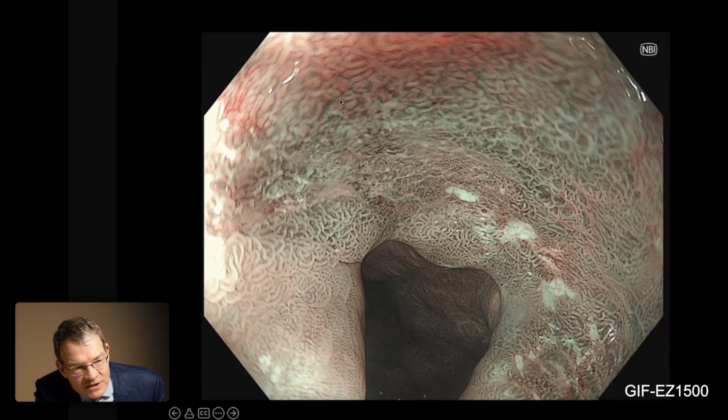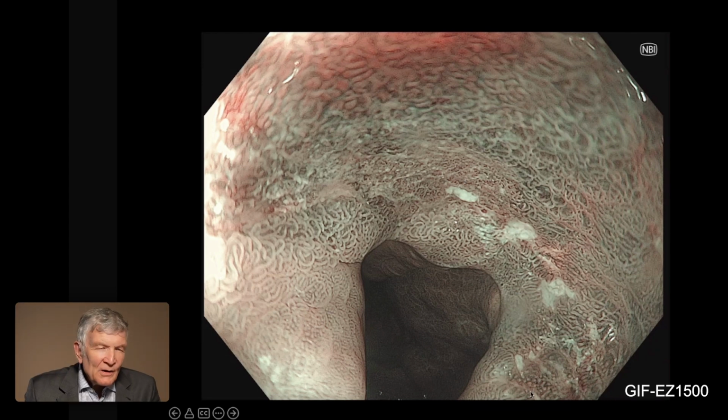This is inflammation. And then another interesting point is also you see the color difference here. This area looks more silver than the surrounding. And for sure you have more atypical vessels here compared to this area. Okay, I out myself as an imaging skeptic, but you're going perhaps to convince me. So let's go on.